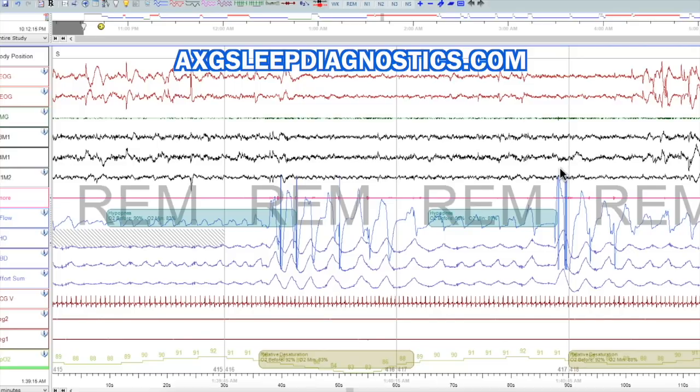Sometimes you'll see other ways that hypopneas manifest in Sleepyhead, and they're probably not real, though it's very difficult to tell a real hypopnea from a non-real hypopnea because you don't have the luxury of having an SpO2 monitor. So you don't get to see this, but you do get to see if there's an arousal or not. And so we can see a little bit of jaggedness on the top of these. And again, that's usually indicative of an arousal.